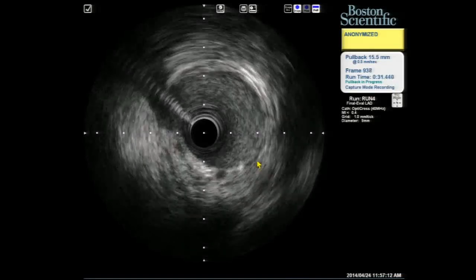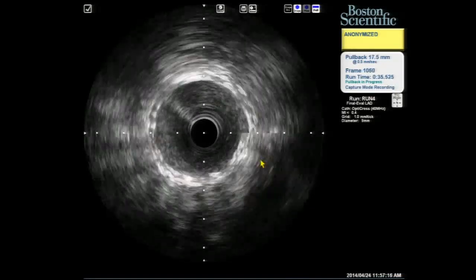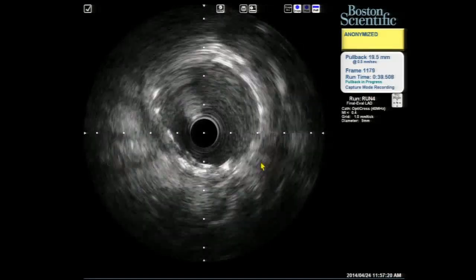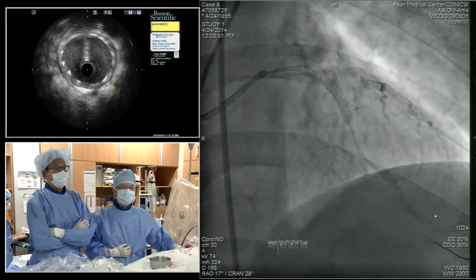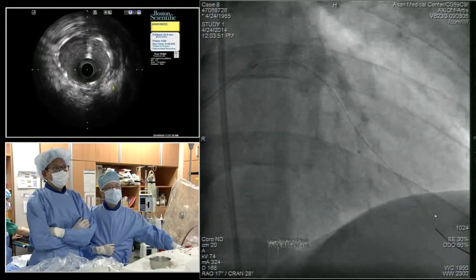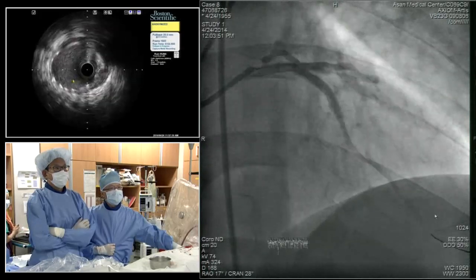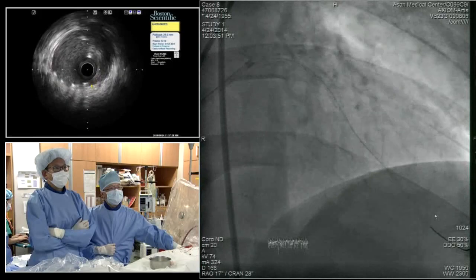Right. So I think that's why it also pushes me to treat the whole proximal LAD, because even if some residual lesion, sometimes in a big territory, you can still bring up an abnormal FFR. So I thought treating that all pretty much to normal would be helpful. For sure. It looks pretty good. It looks like here, if this is the ostium of the LAD, it looks even bigger. It's bigger. Yeah, no, this looks terrific. This is a great case.